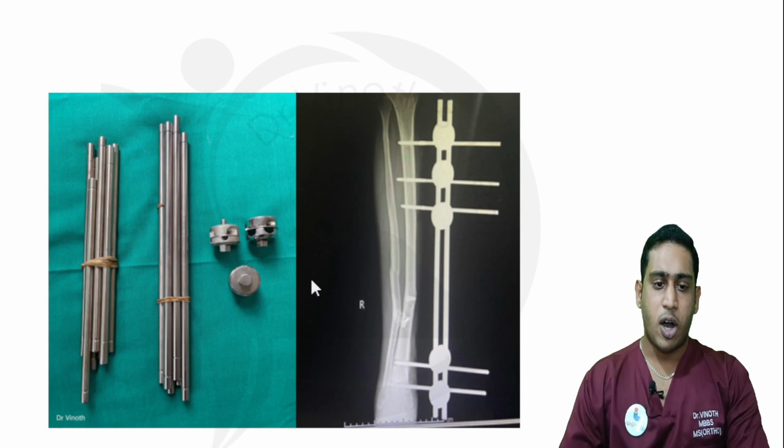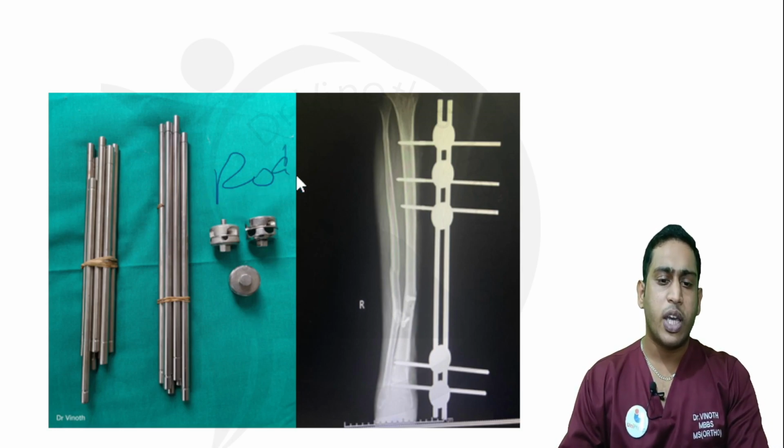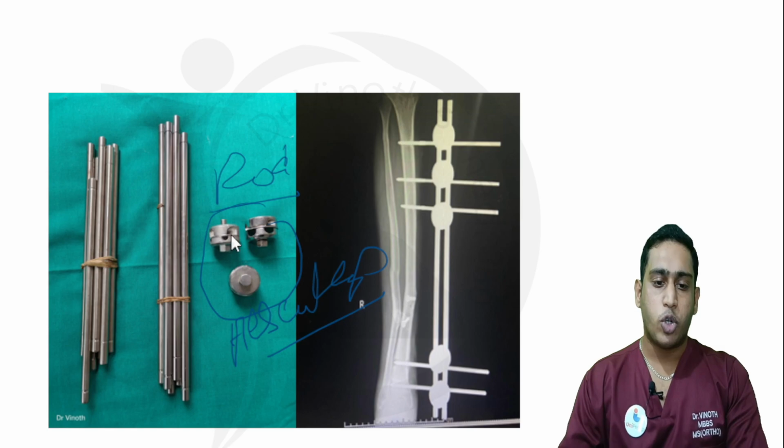Then regarding the components, this one is called an external fixator rod, a universal external fixator rod, and this component is called an AESCULAP clamp. There are two types. The one with a slightly bigger hole is called a rod hole, and this one is called a pin hole. So this one is called a pin to rod clamp, and the one with both rod holes is called a rod to rod clamp.